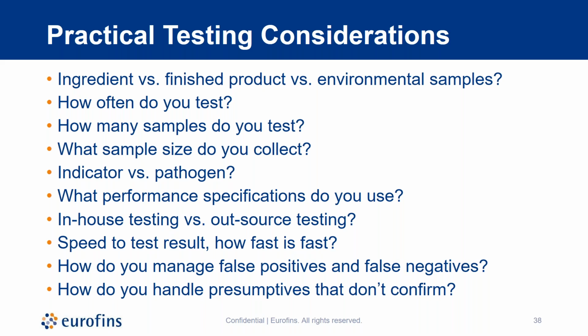How many samples do you test? We've got some International Commission recommendations on the number of samples, and we have very few customers that are even coming close to that kind of sample volume. Again, we all work for a testing laboratory business. We're biased. We'd like to have you send us more samples, but to do really valid sampling plans, particularly for pathogens, when you're not expecting to find pathogens if your food safety program is working.